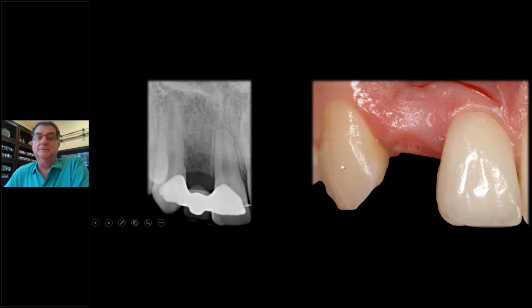So what happens in a case like this where I have a healed ridge? It's not an immediate, or it could be an extraction. This is a congenitally missing tooth where the orthodontist pulled it open and had a bonded bridge to hold it while he was growing. So now he's finished growing, ready to get an implant in there. Now, how do I approach this? I don't want to touch these papilla, but how do I get the implant in?